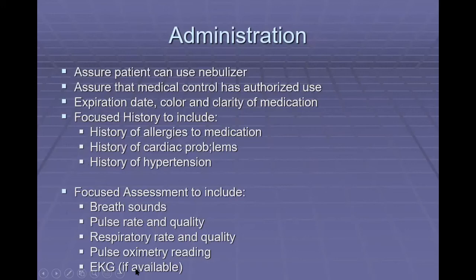So let's talk about the administration of these medications. As you've probably heard me talk as I'm going through this, these medications are given via nebulizer. And so let's talk about how to give a nebulized treatment. So assure the patient can use the nebulizer.